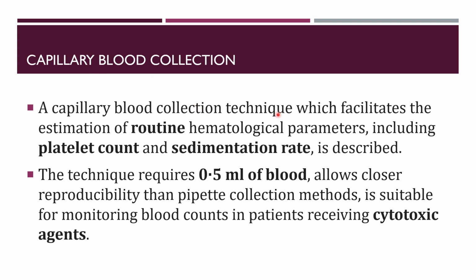It is usually a collection technique which can facilitate the estimation of routine hematological parameters, which consist of platelet count and sedimentation rate. Sometimes you may have seen the laboratory technician taking a small capillary blood sample from the patient for glucose estimation as well. That will be done in the glucometer, right? So that is also done for the routine test.